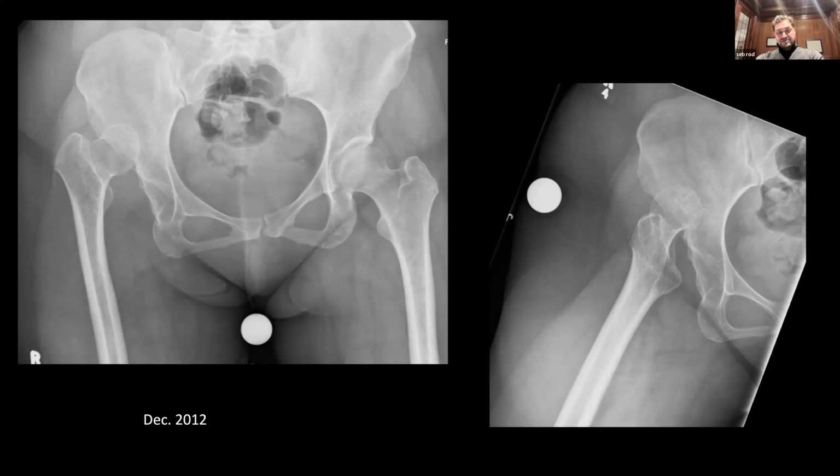And I have to say, after I switched from posterior, the amount of pain is so much less. This person's discharged in a day and feels so much better despite doing a subtrochanteric osteotomy and taking down a lot of that tissue up top to get to that acetabulum and dig out that femur. But they do pretty well. I did these from the posterior approach when I was doing posterior approach, and I appreciate and respect all the ideas of feeling the sciatic nerve, but now you can still feel it in the back of the leg. But my preference personally is to do these through the anterior approach.